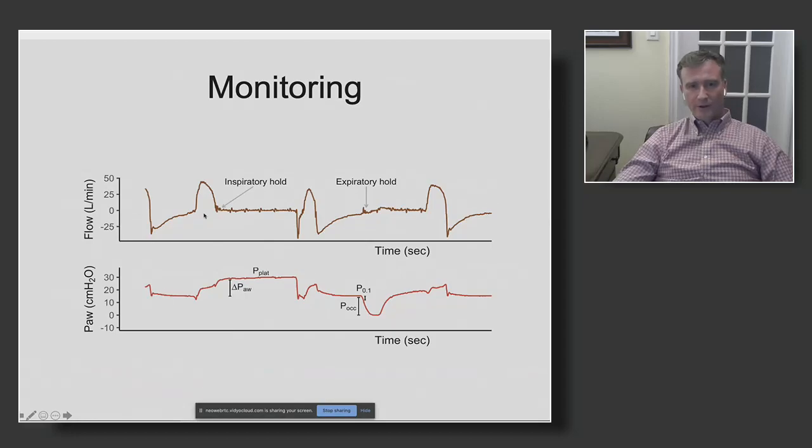You have inspiratory flow here, and you can see we've applied an end inspiratory pause. So the end inspiratory pressure here actually increases during the pause. And this is because the pressure we see in the lung now is not only that delivered by the ventilator, this airway pressure increase here, but also that resulting from the patient's own efforts. But in many patients, we can still get a relatively reliable driving pressure measurement that allows us to assess just how much the lung is being distended.